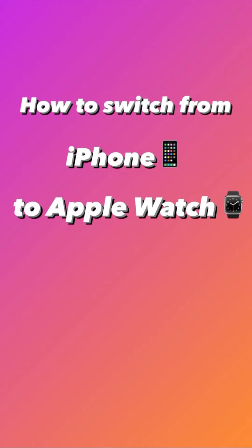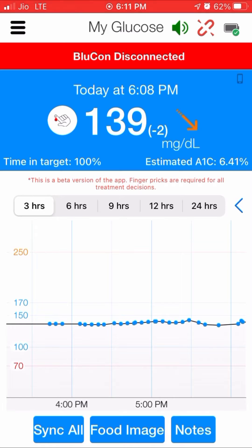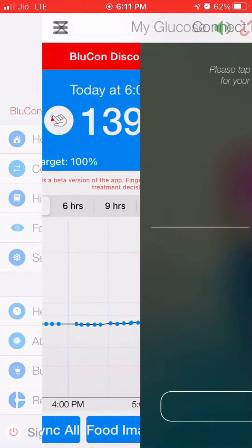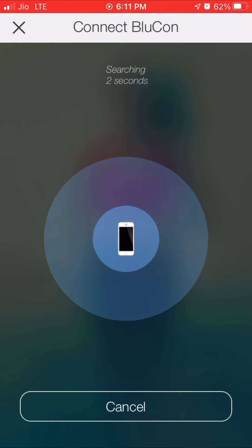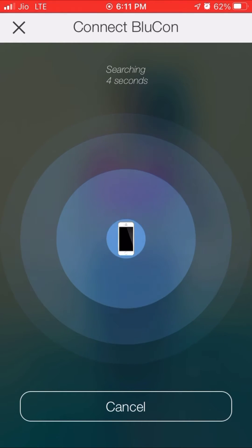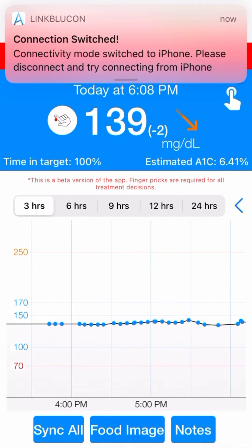In this video we'll see how to switch your connection from iPhone to Apple Watch. First, open the LinkBluecon app and connect the Bluecon with the LinkBluecon app and enter the six digit passcode. Now we are waiting for the Bluecon to connect.